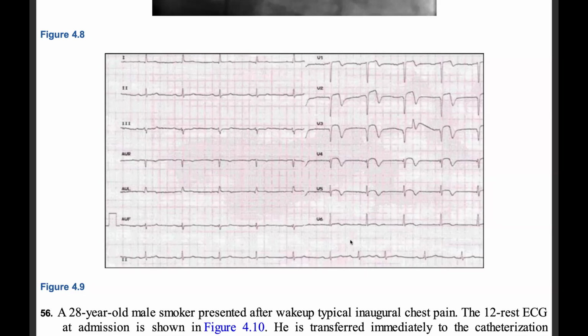This is an MI now. I don't know if there are other findings I can locate on the ECG. If anyone can look at it.